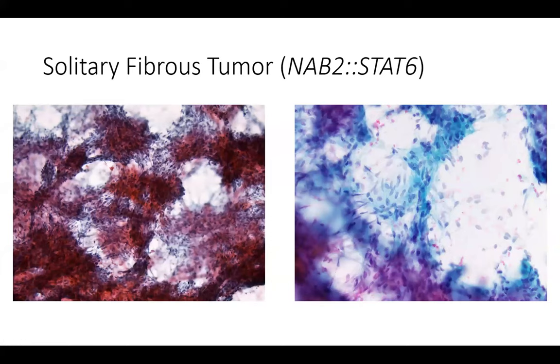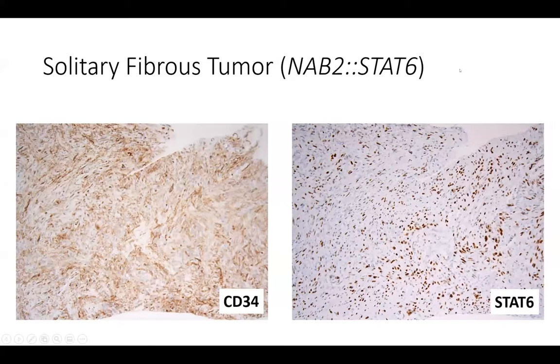So going through some diagnoses of soft tissue spindle tumors that will enter this sarcoma or higher grade pattern. So solitary fibrous tumor, which is actually an intermediate biologic risk, rarely metastasizing. These will often yield busy fragments of anastomosing spindle cell fragments, but will also have spindle cells that spill off the fragments and fill the background. These are conventionally known to be positive for CD34. And we also know that these will overexpress STAT6.